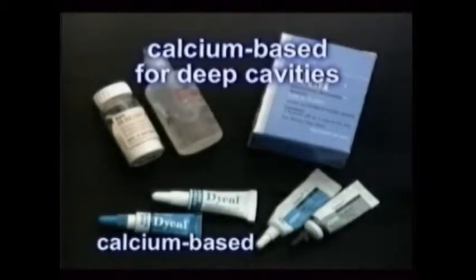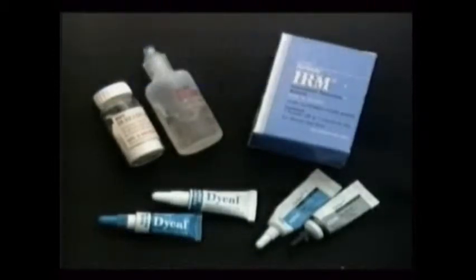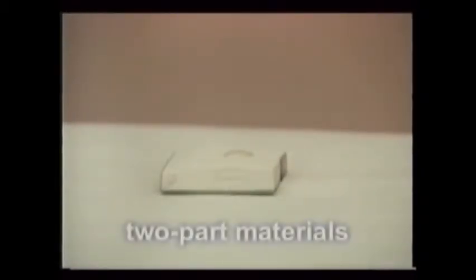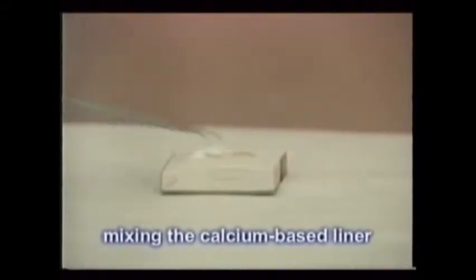A calcium-based liner is used when a filling is extremely deep, and then a stronger base is placed over it. These bases and liners are usually two-part materials that set up in a short time after they're mixed together on a disposable pad or a glass slab. Special placing instruments are used — periodontal probe-like instruments for painting calcium hydroxide, like the Dical brand, and then two-ended temporary placing instruments to load and pack the stronger base materials, like the IRM brand.